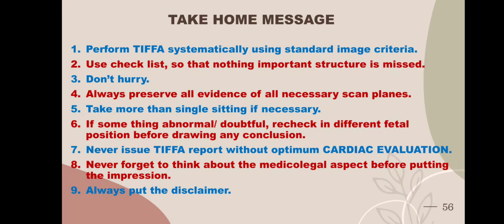Fifth, if visualization is suboptimal, do not hesitate to rescan after maternal movement, fetal movement, bladder emptying, or even on another occasion. Sixth, whenever you encounter a doubtful finding, reassess it in multiple planes and in different fetal positions before reaching a conclusion.